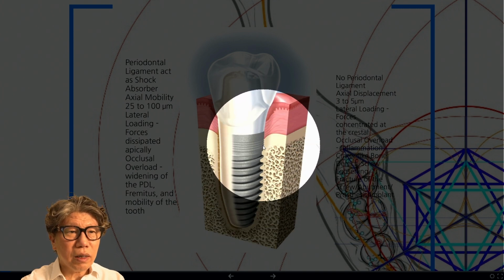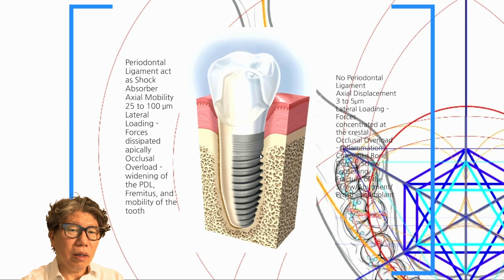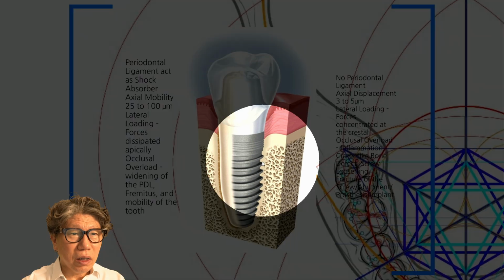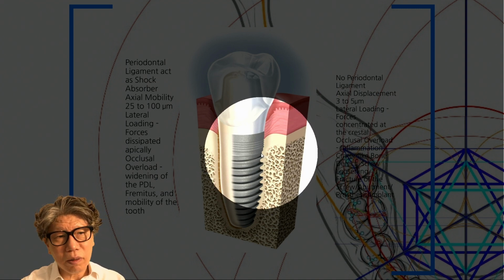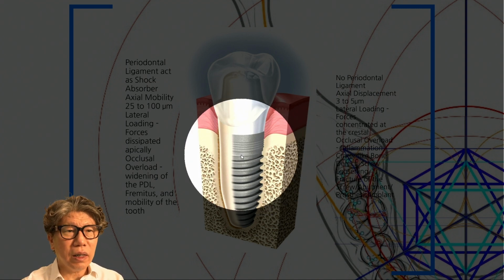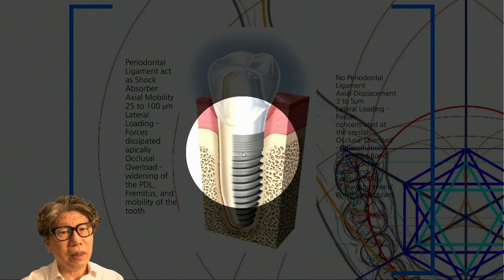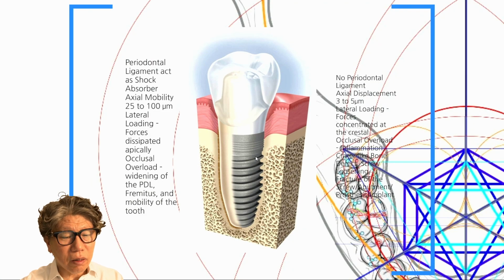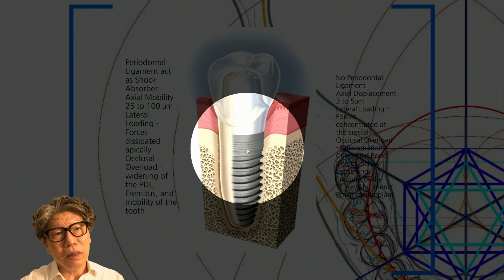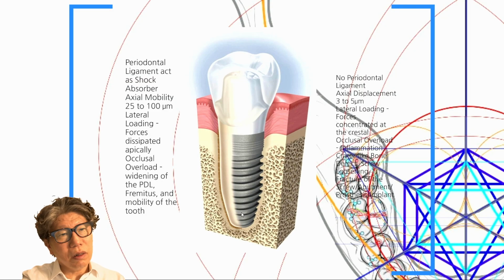the implant makes direct contact with the bone tissue. We call this osseointegration. This is expressed as the bone attaching, but it is said that it does not actually attach. Most implants have a titanium surface. There are also HA coating methods and various manufacturing methods or surface treatments, but there is something called an inert material. When the titanium surface of an implant is exposed to air, it becomes coated with a TiO2 layer, known as an oxide film. Unlike stainless steel metal which rusts, it is surrounded by this oxide film. And this oxide film prevents any harmful effects on the bone tissue and human tissue.